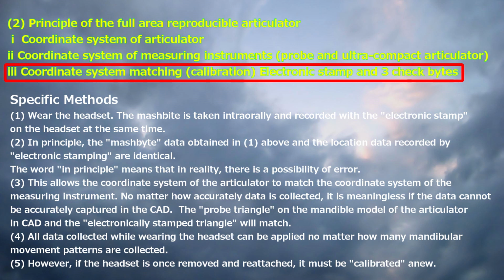3. This allows the coordinate system of the articulator to match the coordinate system of the measuring instrument. No matter how accurately data is collected, it is meaningless if the data cannot be accurately captured in the CAD. The probe triangle on the mandible model of the articulator in CAD and the electronically stamped triangle will match. 4. All data collected while wearing the headset can be applied no matter how many mandibular movement patterns are collected. 5. However, if the headset is once removed and reattached, it must be calibrated anew.